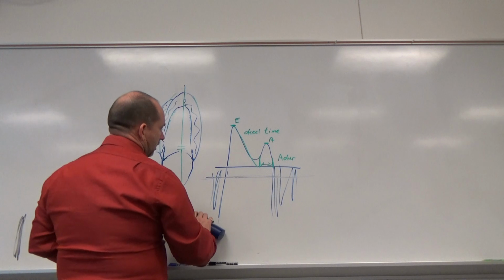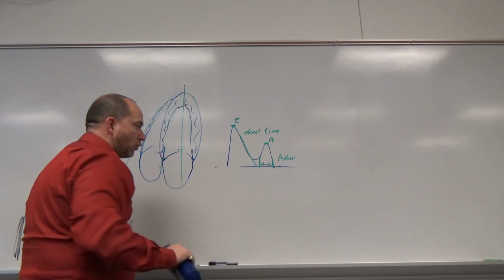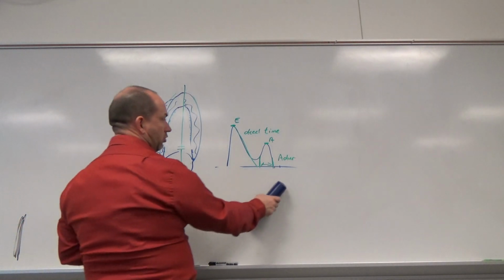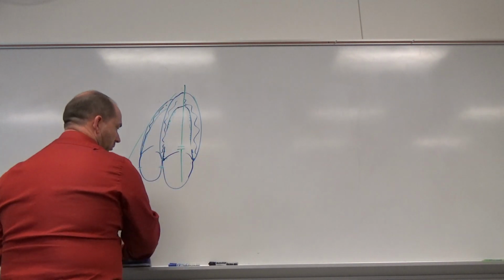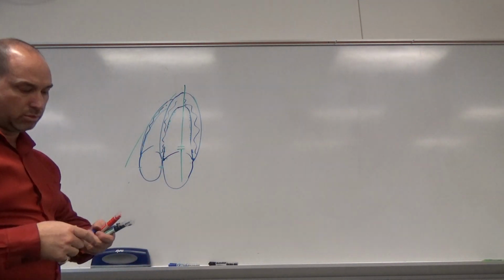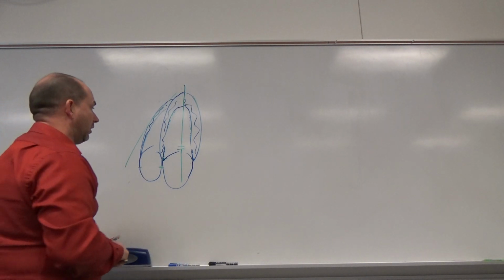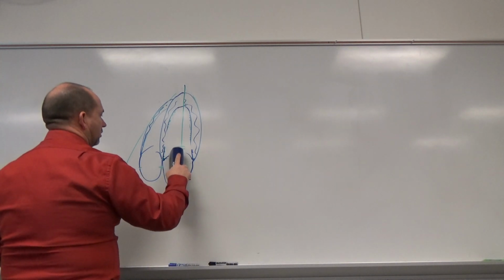Okay? That is on a normal heart, that's what we're going to measure, and we're going to kind of stop at that. There's other things we can do if it's abnormal. We'll talk about those in next quarter. We'll use CW next quarter when we get into pathologic conditions, but in a normal heart, this is all we're interested in right now.